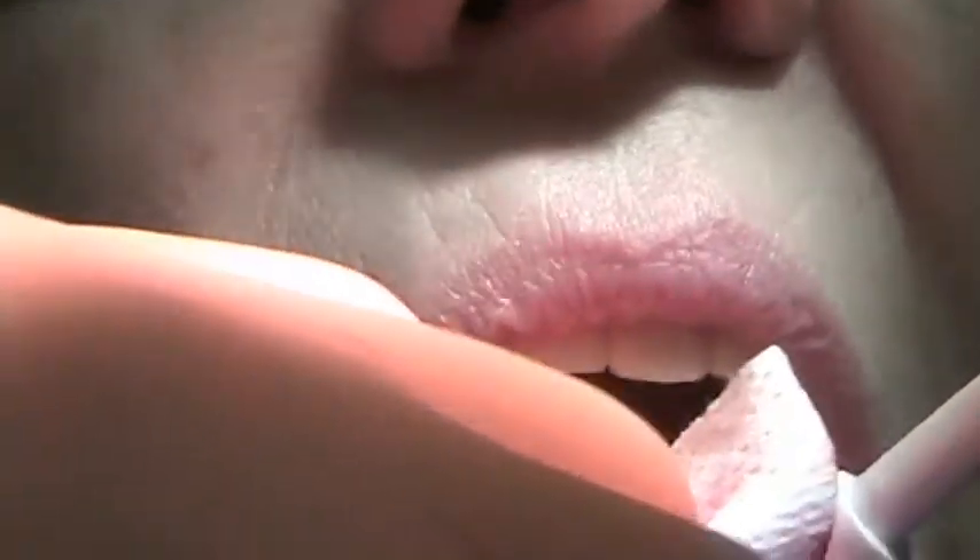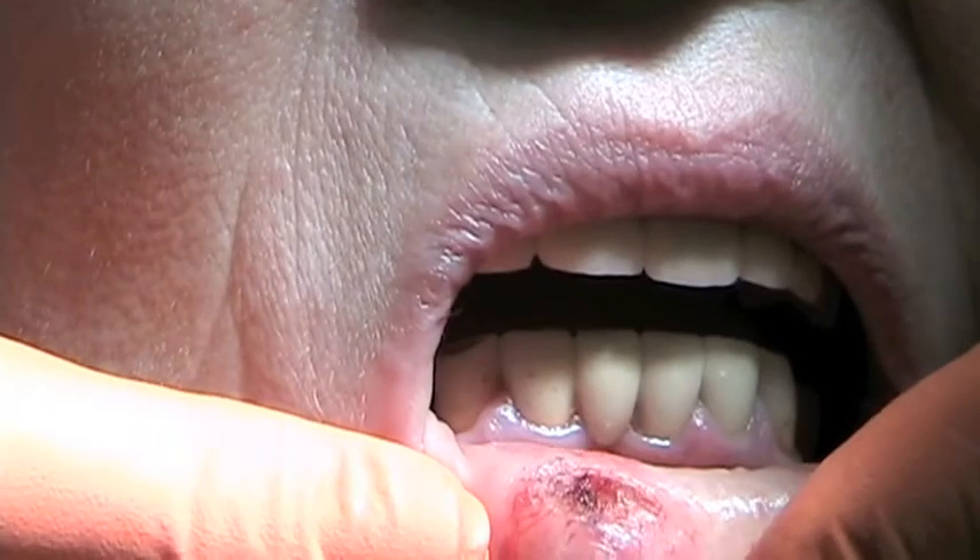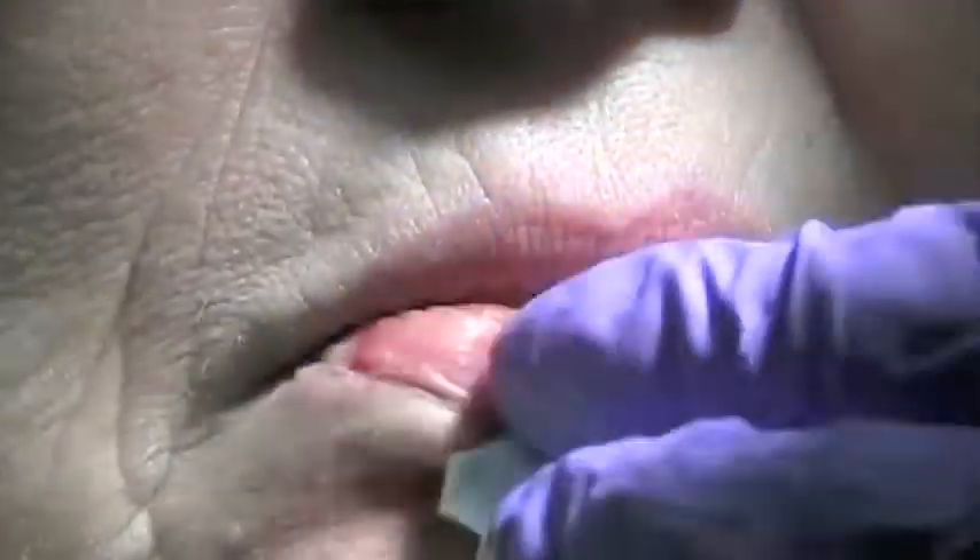Before, we used to stitch it together and we'd get a contracture, and sometimes we would actually go in and block off a little saliva going in this way to avoid that. You did great, Anna. You did great.